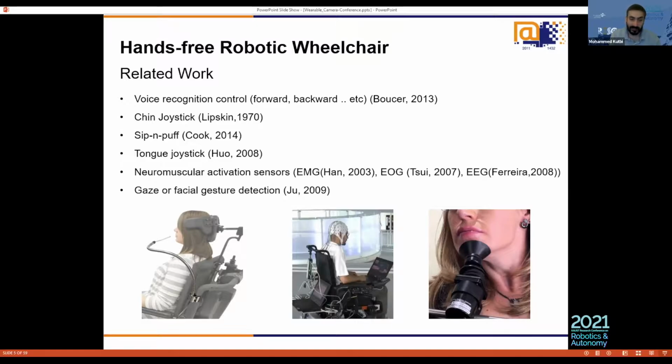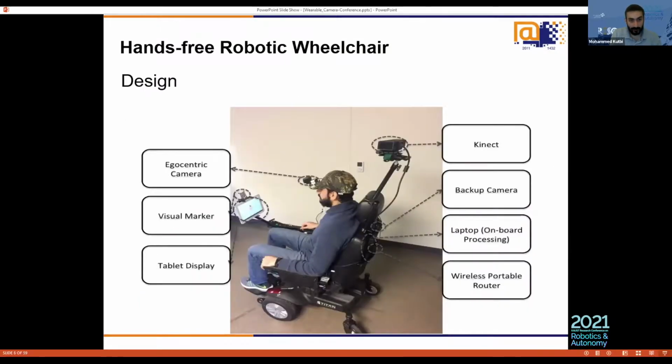And the third one is allowing continuous directional control, not only going backward or forward or right or left. We want to have omnidirectional control, where you could go 360 different orientations and multiple levels of speed. If you think of the voice control command, there's one speed. You can say go forward or go back, but you cannot say go 3 degrees to the right or 4 degrees to the left. It gets a little more difficult. So that's where we designed our method towards.